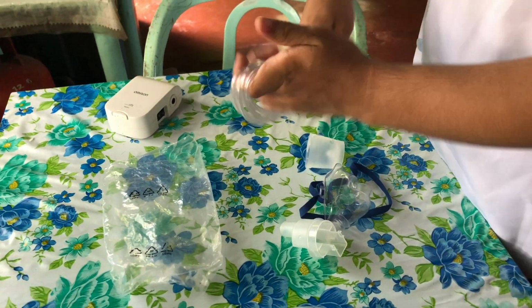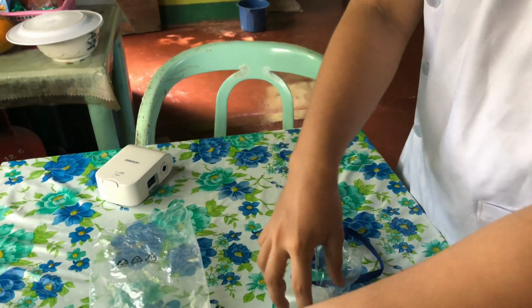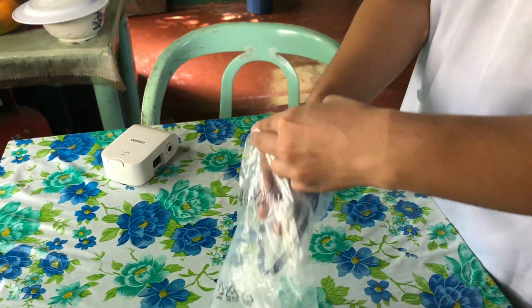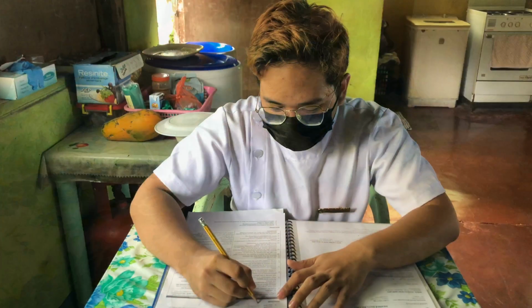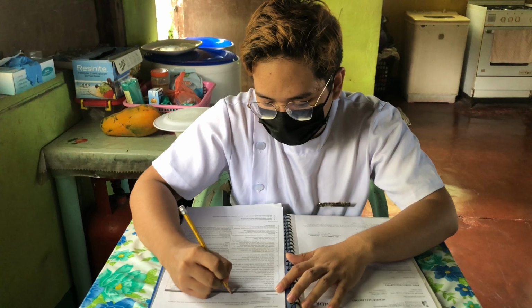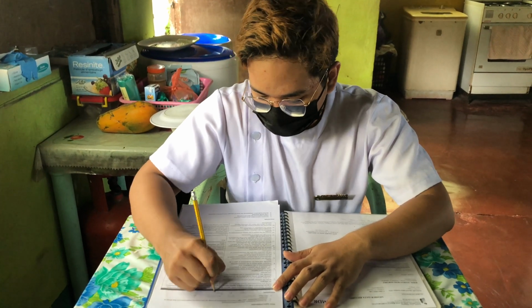Retain the equipment in a polythene bag for the patient's next administration. To prevent infection, the equipment should be changed every 24 hours. Document the nursing practice appropriately. Monitor adverse effects and report any abnormal findings immediately.